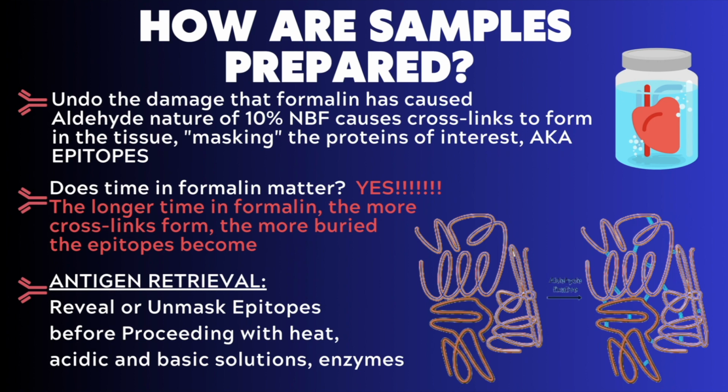Since we will be talking about one kind of antigen retrieval step in the next slide, I should mention the precursor to this step. We all know that 10% neutral buffered formalin is considered the gold standard fixative in the clinical pathology laboratory. It's a wonderful fixative, and it helps preserve the structure of tissues. However, there are downsides of aldehyde-based fixatives. One of those downsides is cross-link formation. Cross-link formation is excellent for tissue stability. However, it is prohibitive for epitope accessibility. In order to proceed to perform IHC, we must first loosen or break those aldehyde crosslinks.